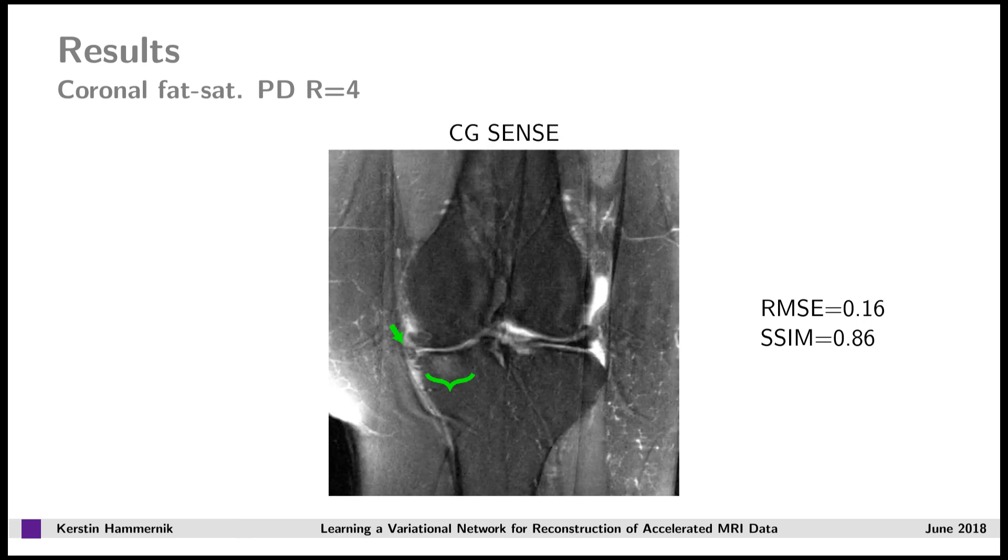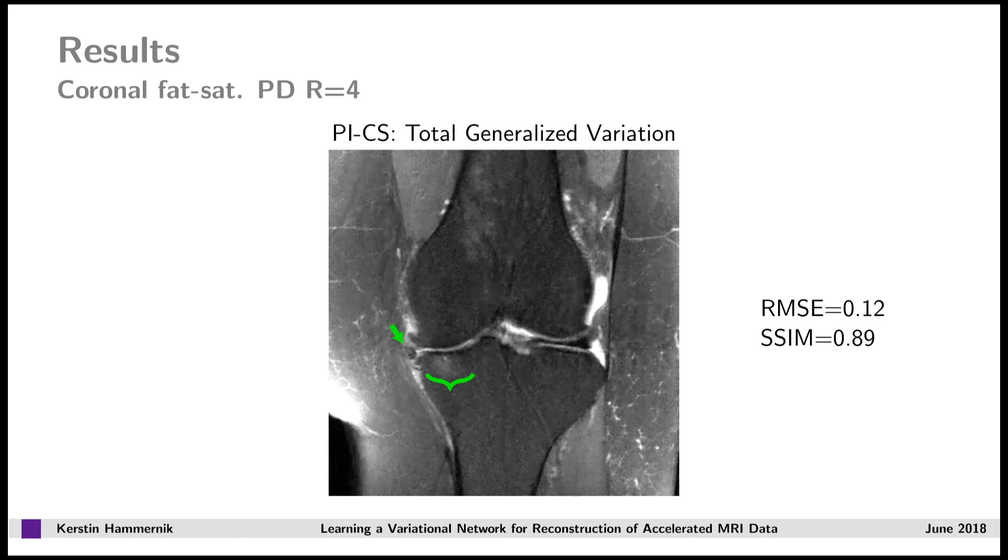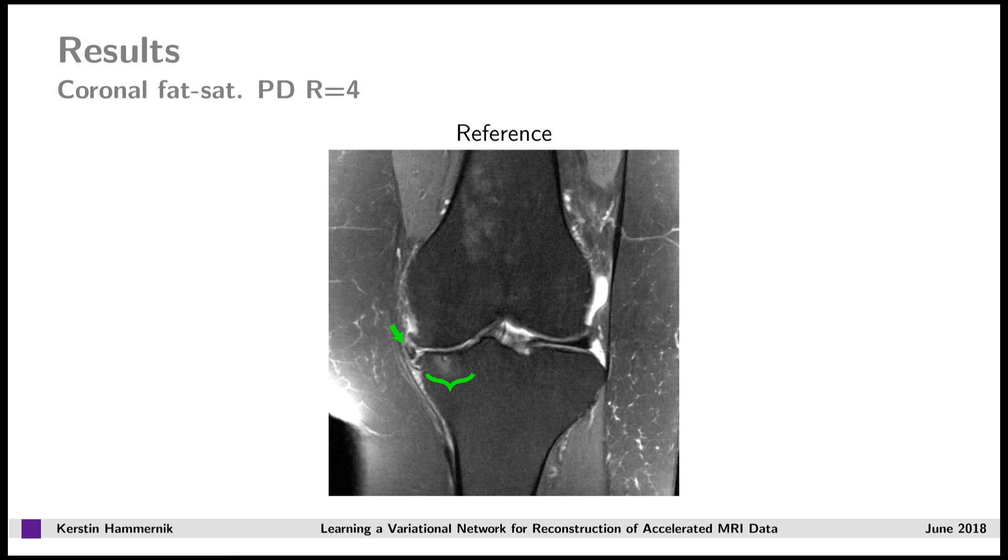The SENSE result, which is optimal in terms of RMSE, shows a lot more of residual artifacts. If we look at the total generalized variation reconstruction, the image looks blocky and unnatural at this level of SNR. Also, the dictionary learning result shows remaining artifacts here. Again, our variational network reconstruction shows improved image quality in terms of sharpness and suppression of undersampling artifacts, and in terms of quantitative error values. Here we have, again, a comparison to the fully sampled reference.